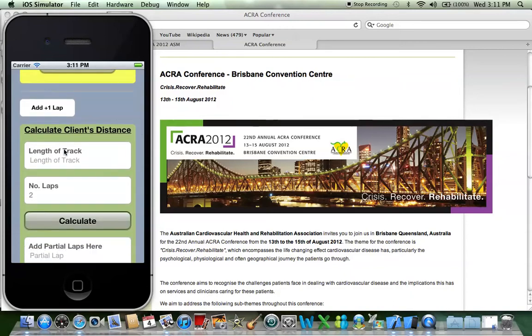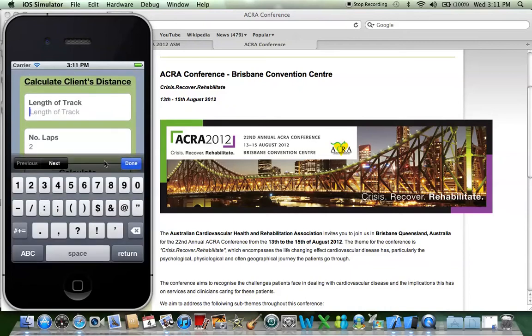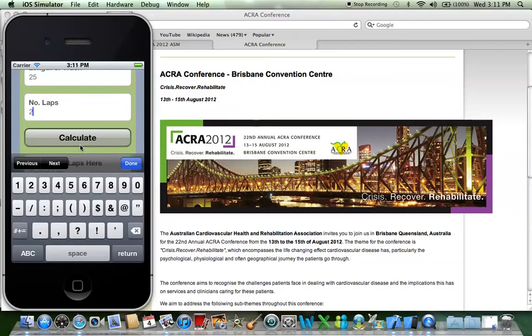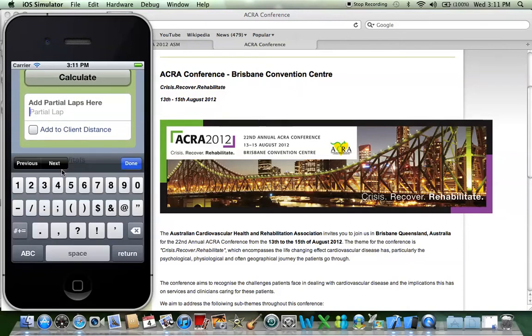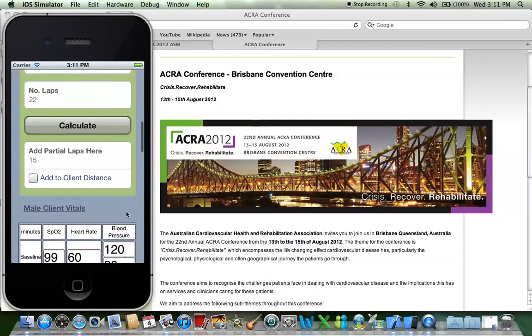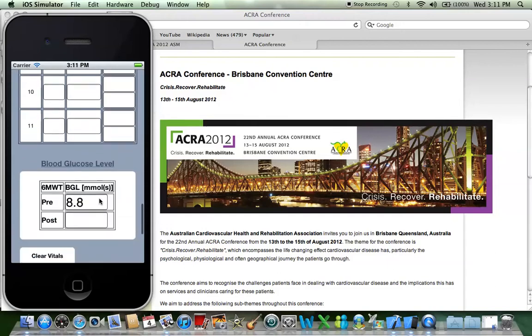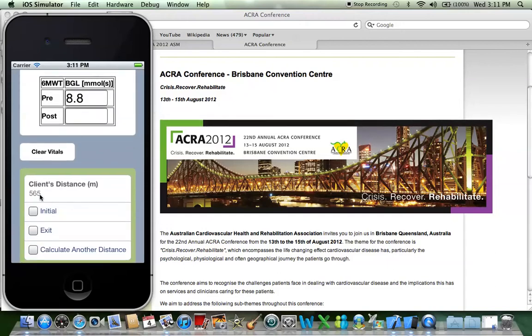Now to calculate the client's distance, you need the length of the track. Let's put in 25 as an example. Let's say the client does 22 laps, and let's say they stop in the middle of the track and do 15 meters. We can calculate that and also add the meters. Let's scroll down like the message said — and there it is.